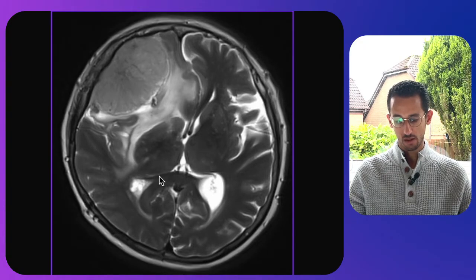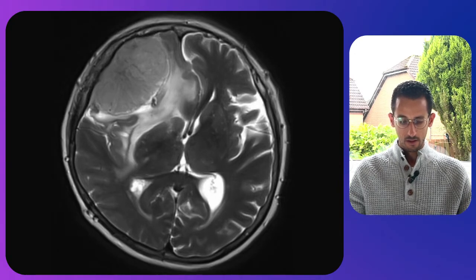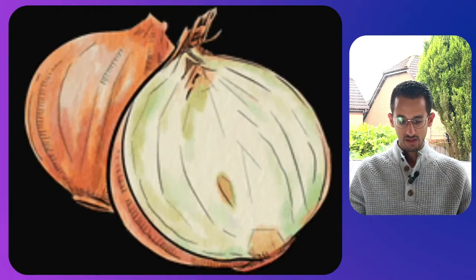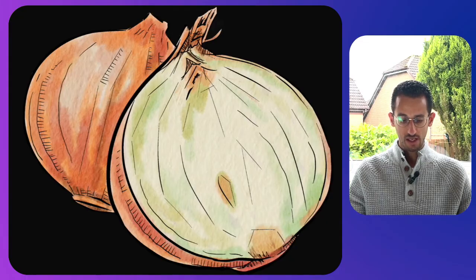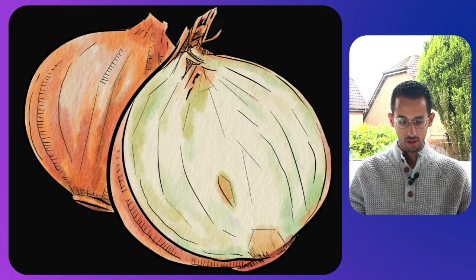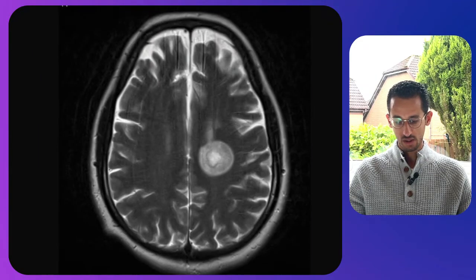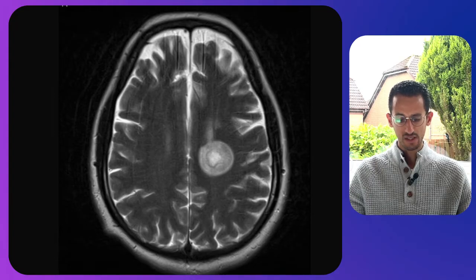The next one is the onion skin appearance, which can be seen in Balo's concentric sclerosis — like in this picture where you can see an onion peel appearance.